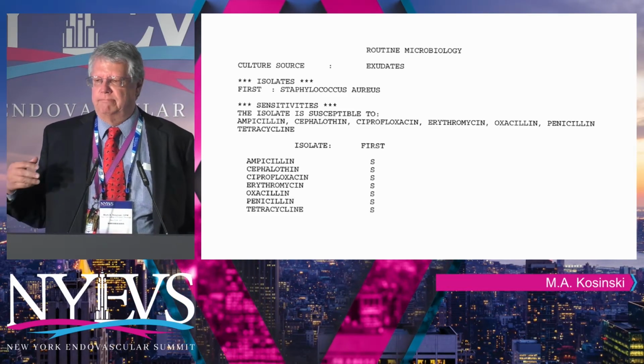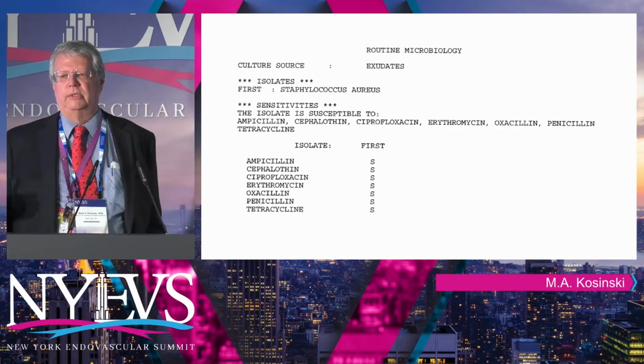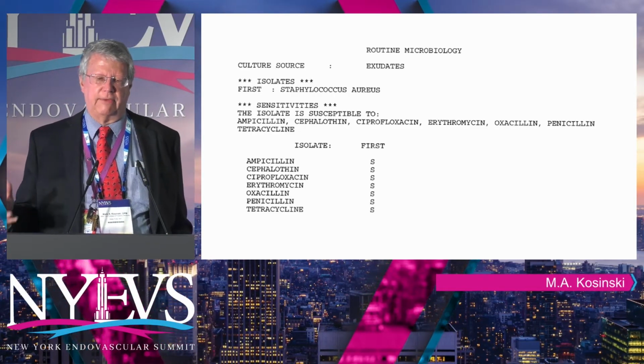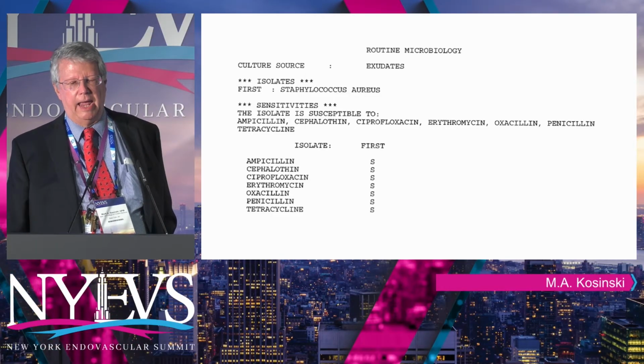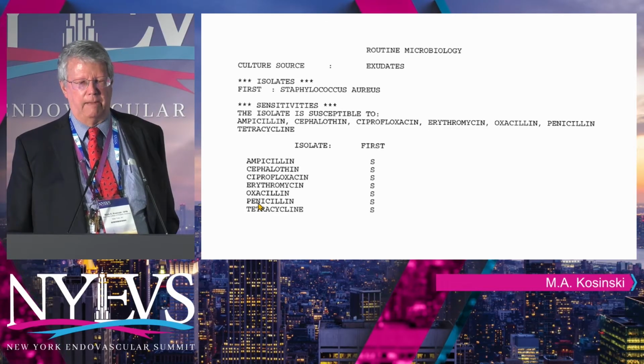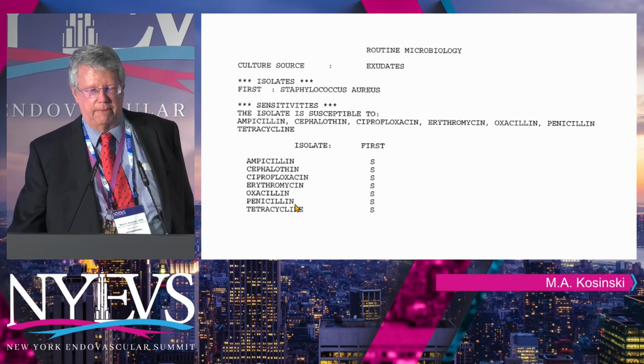because most of the strains of staph that you and I are going to deal with produce beta-lactamase. This is pan-sensitive staph. This strain of staph does not produce a beta-lactamase, and we know that because it's still susceptible to drugs like ampicillin, penicillin, and by extension, amoxicillin.